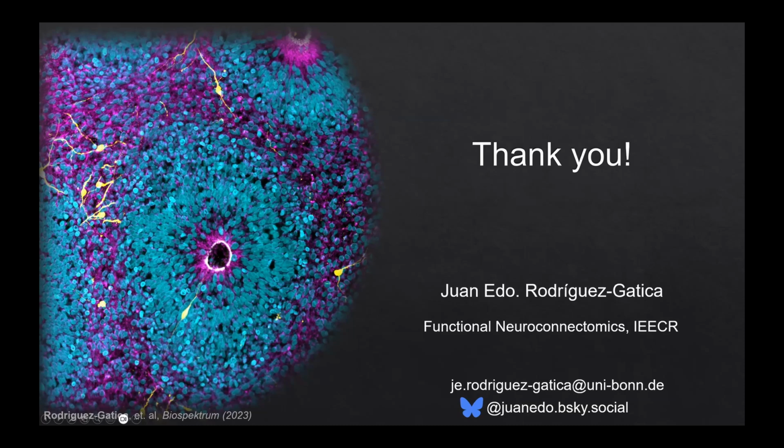I'm wondering why proteinase K does not digest Matrigel, which is a protein somehow. It's because you don't have only proteins. I mean, you also have collagen, or you could have fibrin. And at least in our experience, if the concentration of those is too high, then proteinase K is not good enough to digest everything. So you would like to either add something else to get that out.